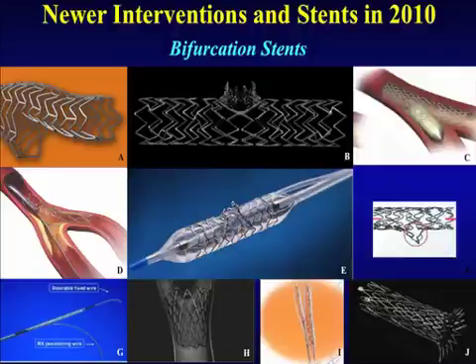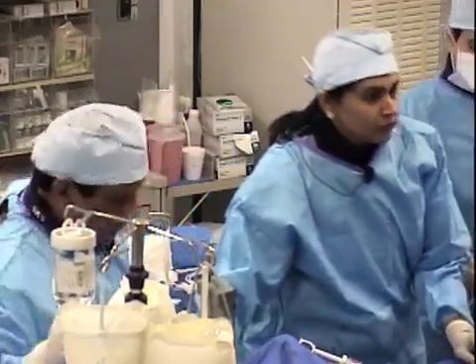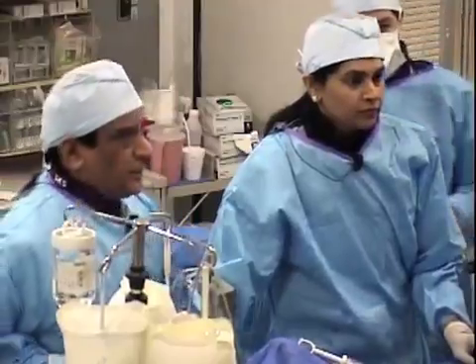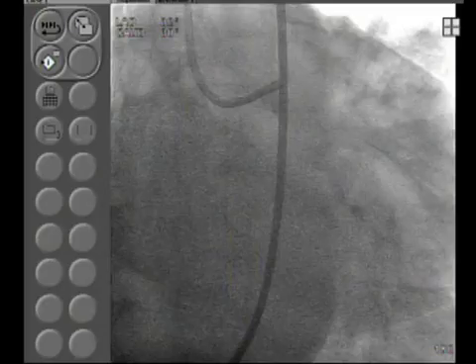Now, with that note, I will go back to performing the angiogram, and Anu has already engaged it, and we are ready to do an IVUS of this calcific lesion while you take some questions and we answer them. So, the first question which has sprung up is, why has it been so hard for the company to improve the Rotawire? Yeah, that's a very big question.